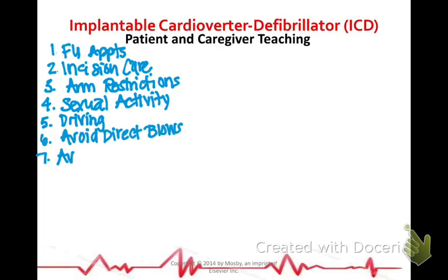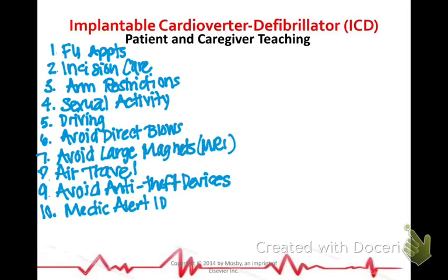Driving is restricted. Avoid direct blows. Avoid large magnets like an MRI. Same thing with air travel. Make sure security knows. Avoid anti-theft devices. Medical alert ID. They want an identification card in your wallet.